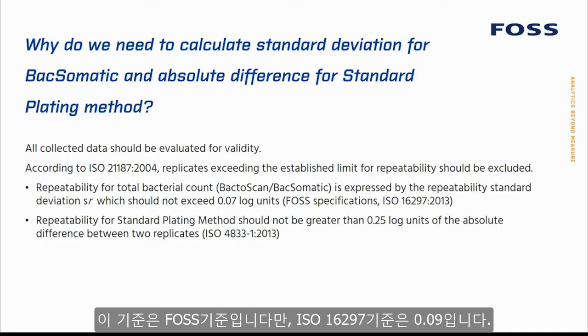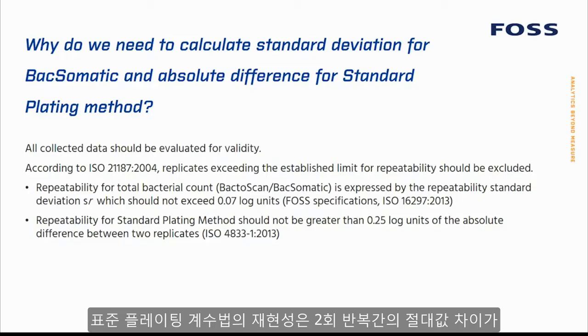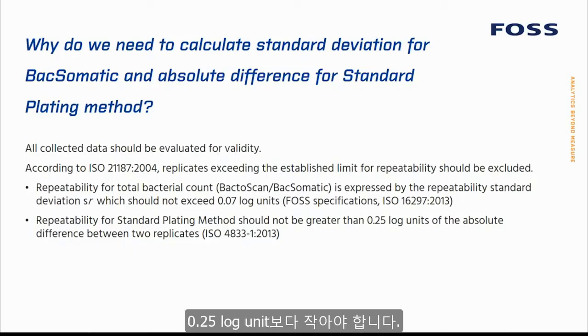However, ISO 16297 says that it should not exceed 0.09 log units. Repeatability for the standard plating method should not be greater than 0.25 log units of the absolute difference between two replicates.